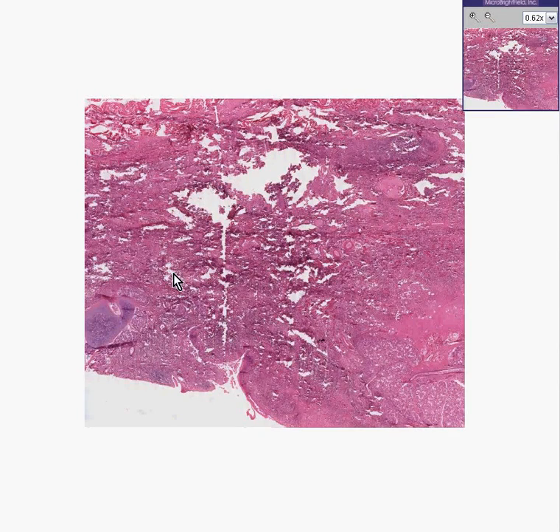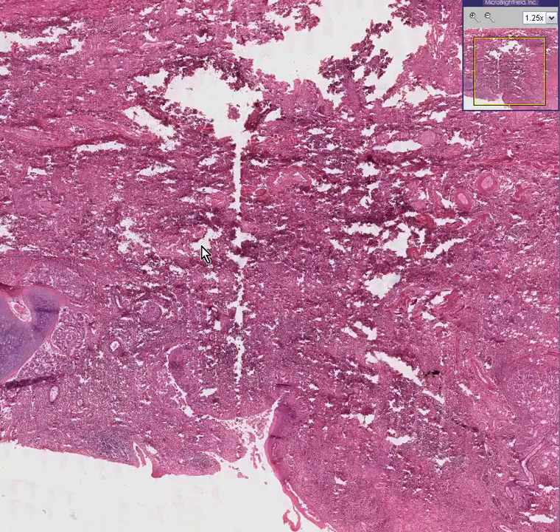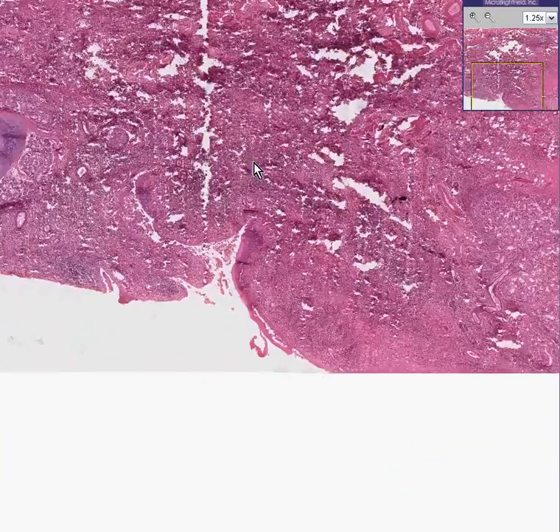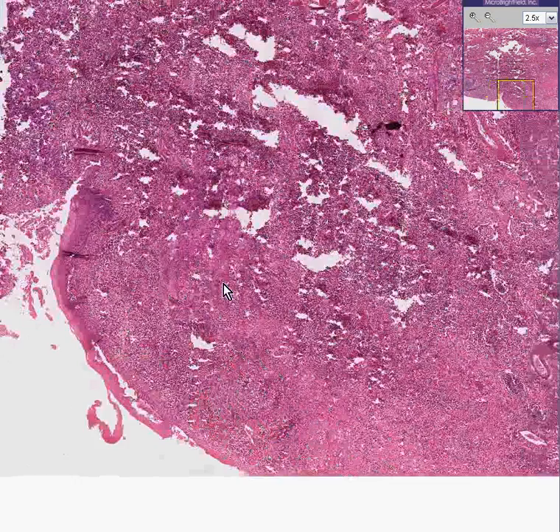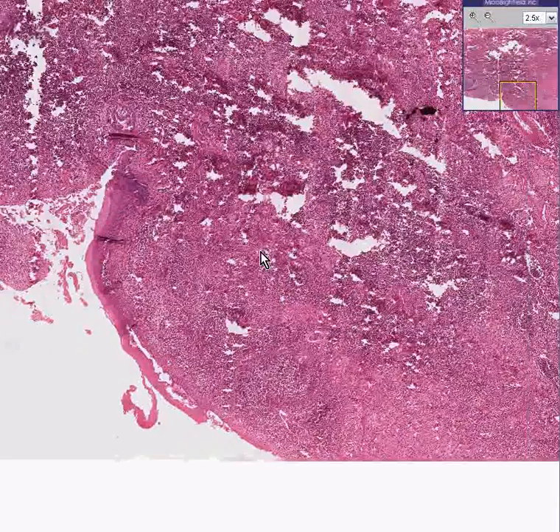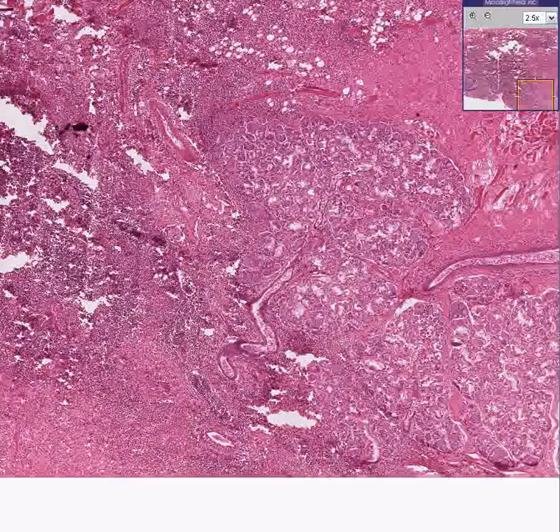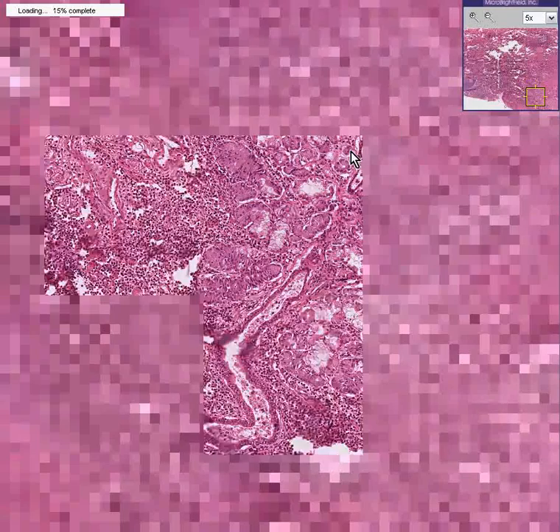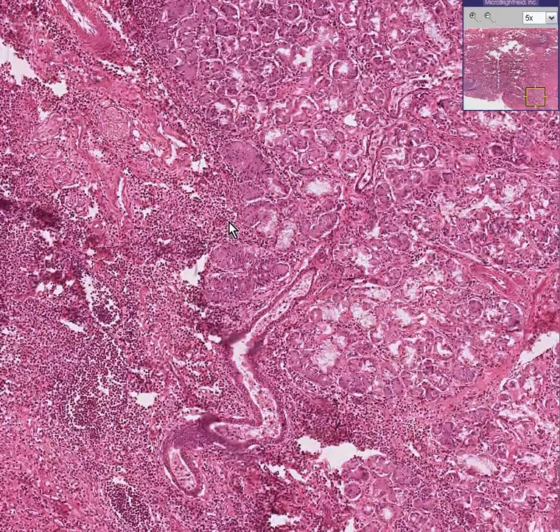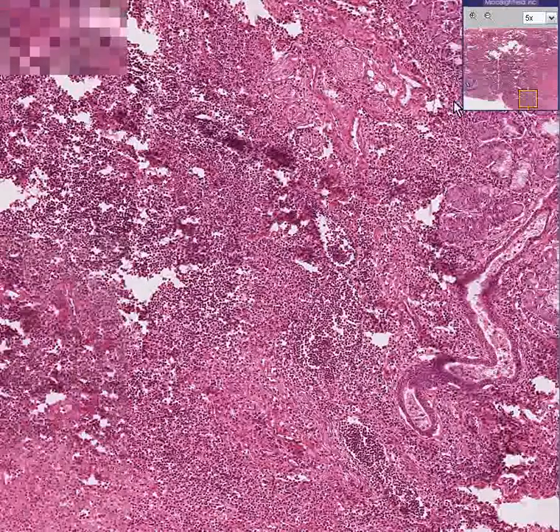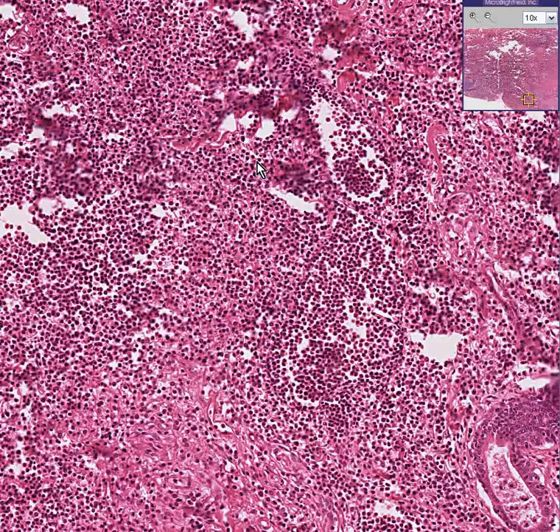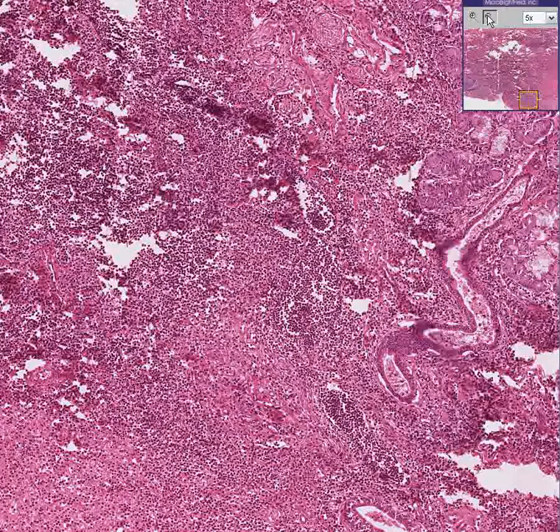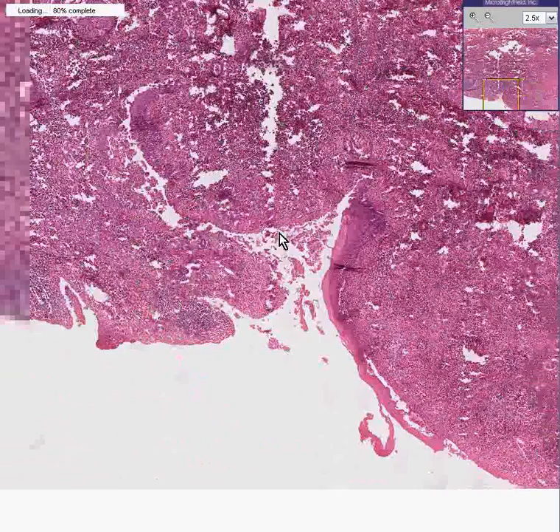What do we have here? I think I can see a piece of cartilage. I think I can see a strip of squamous mucosa. I think I can see some submucosal glands that basically look like they're sort of mucus. I can see a whopping infiltrate of acute inflammatory cells and fibrin. We already know we're dealing with the upper respiratory tract for all those reasons. This is the larynx.